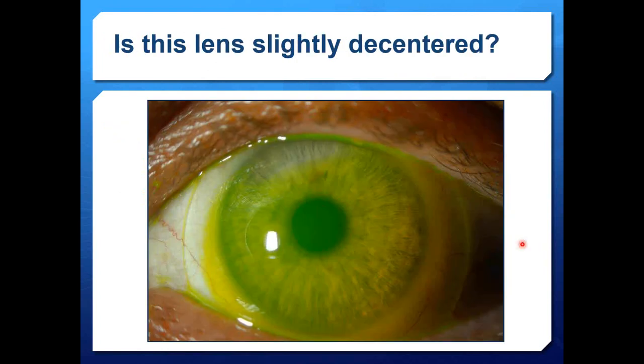Now, why is this scleral lens riding slightly low? What's contributing to this lens wanting to decenter? Is it corneal asymmetry? Is it a deep displaced corneal apex? Well, if our scleral lens is vaulting the cornea, then really the apex of the eye matters very little. So why then do we see on this left eye that this lens is riding a little bit toward the low side? That may be because the majority of scleras that we see are with the rule, with the vertical meridian being deeper. Then we have lid force and gravity pulling the lens down.